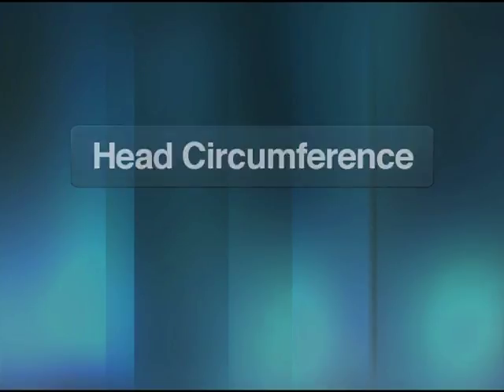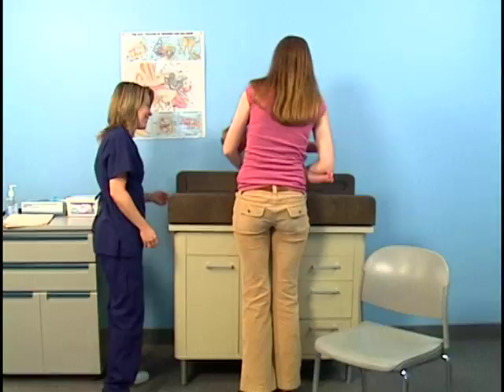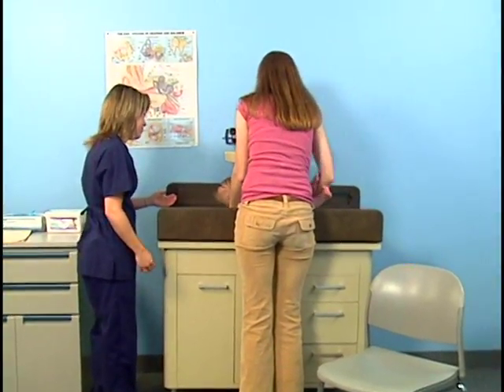Position the infant. An infant is usually more content if he is held by his parent. The infant can also be positioned on his back on the examining table. The medical assistant will first demonstrate how to measure head circumference using a pediatric circumference band.